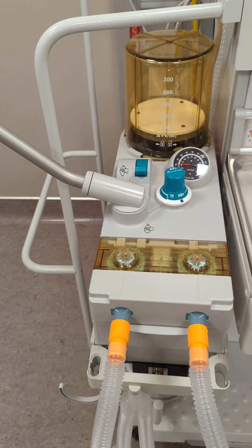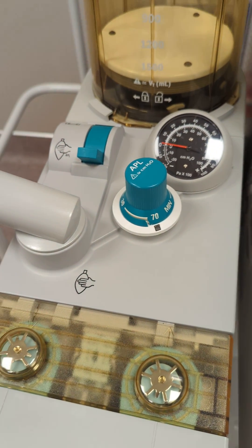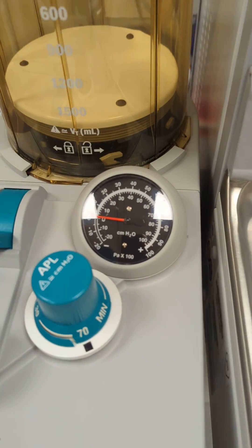Now you will need to pressurize the system. Increase your APL valve to 70 centimeters of water and use your O2 flush located on the front to increase the pressure in the system to 30 centimeters of water.